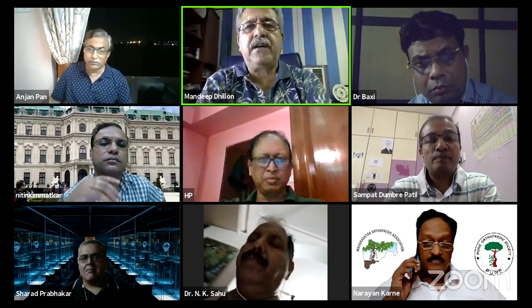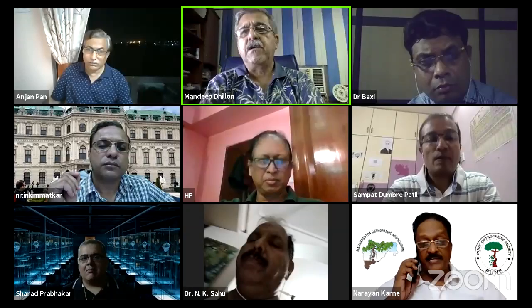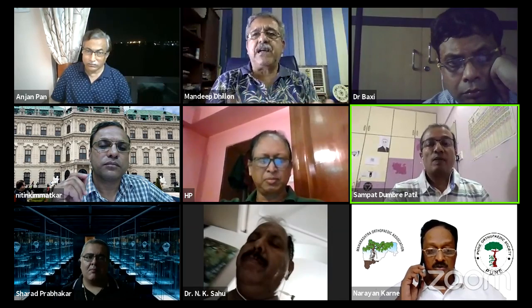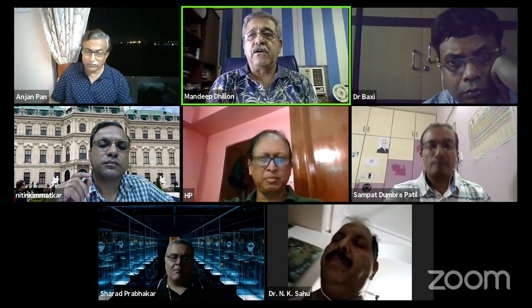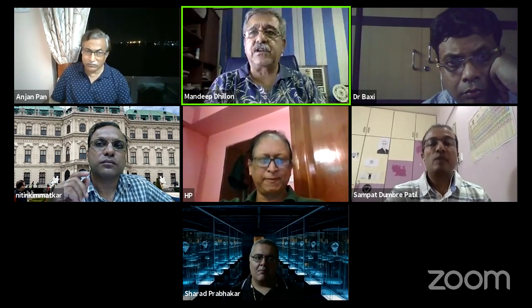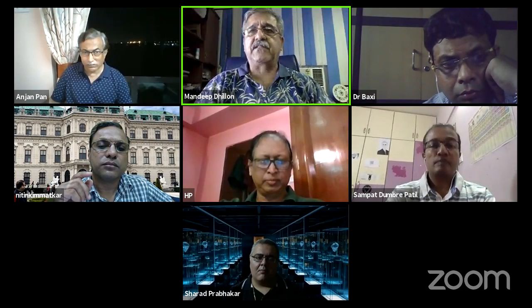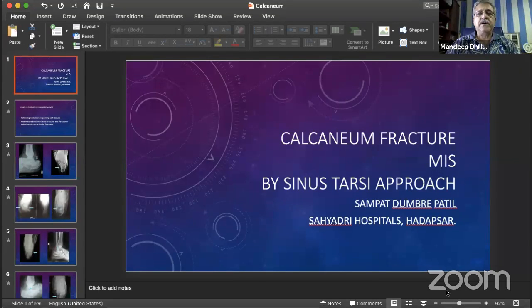You see, these were studies done from 2005 to 2016, when the understanding of fracture patterns and reductions was still developing, because this was the same time when people were not very comfortable fixing fractures of the calcaneus. Then they started fixing them, and most of the people who did not have experience always had a skin problem with an extensile approach. As people became experienced, their problems with skin incisions became fewer. But also, they were able to reduce fractures by indirect methods.